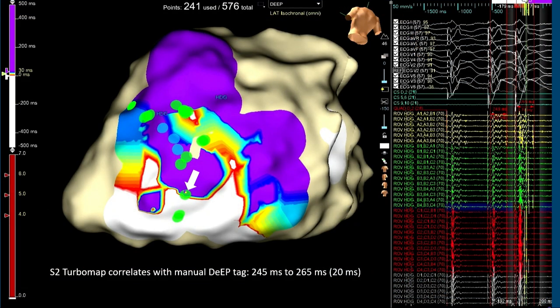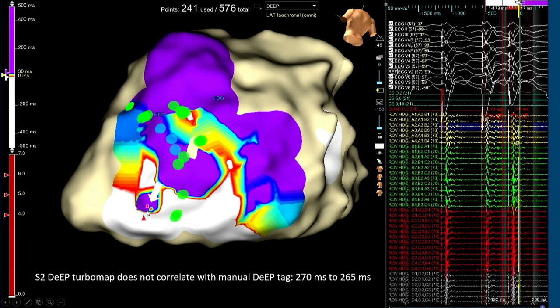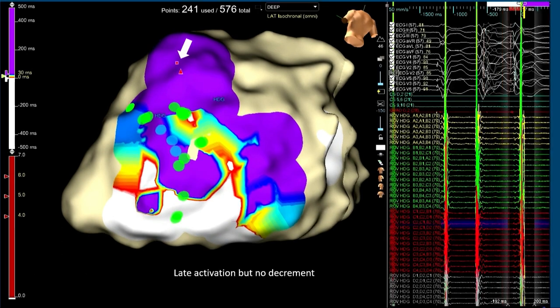The importance of manual tagging: a green tag marks a known decrementing location. The last deflection map of the S2 with purple for anything late overlies this nicely. Measuring EGM duration from S1 to S2 shows a 20-millisecond difference—this is genuinely decrementing. In contrast, another area tagged as late shows S1 EGM duration of 270 milliseconds and S2 EGM duration essentially the same—this is a false positive. Another area labeled as late is simply normal healthy myocardium activating late due to sinus wavefront propagation.